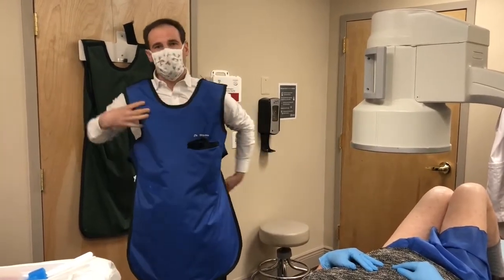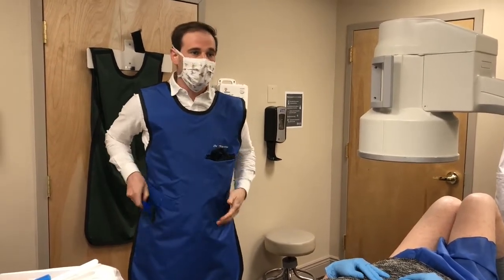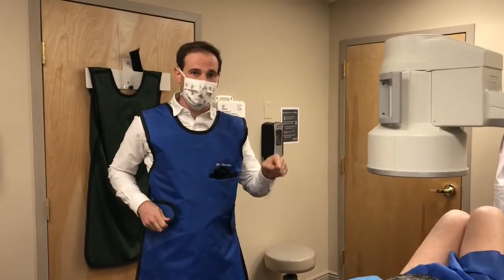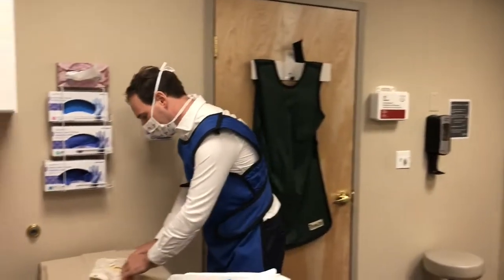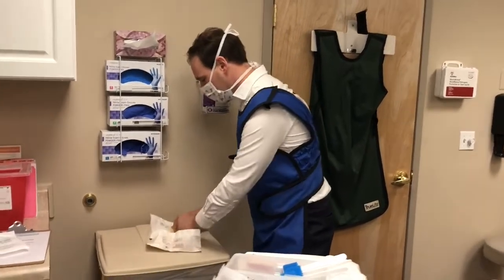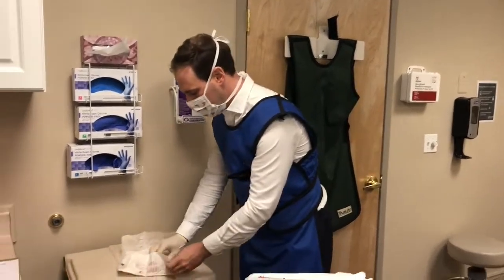Giving a hip injection is a little harder than giving a knee injection because the hip is deeper within the body. So to do a good job, we use an x-ray machine right here and we're going to watch the needle as it goes into the joint and make sure we really hit the right spot. The first part about giving an injection is making sure that we keep everything sterile, so I use these gloves, and also because we're using a little bit of x-ray, I wear this gown to protect myself.